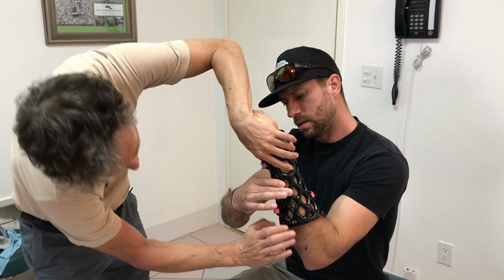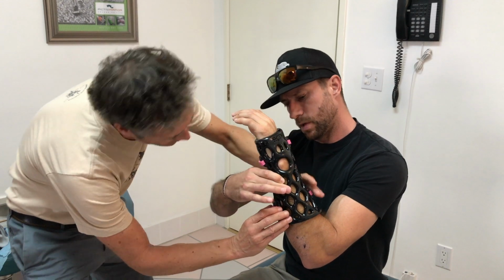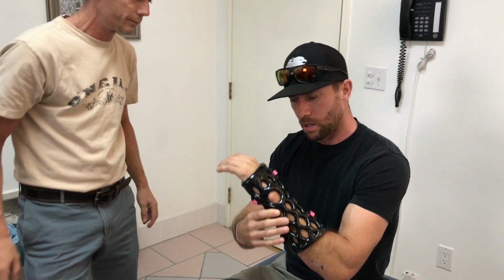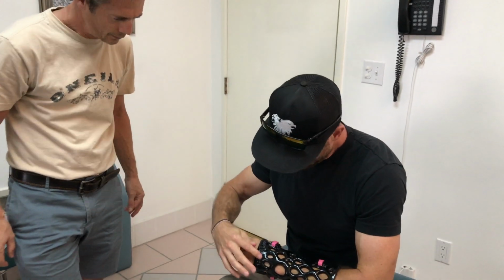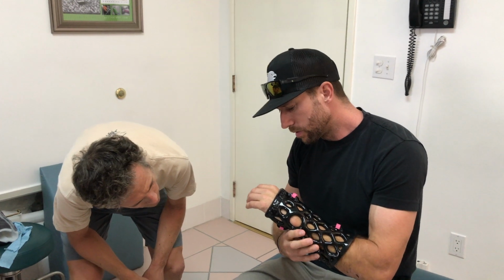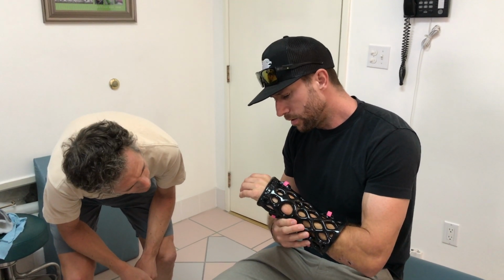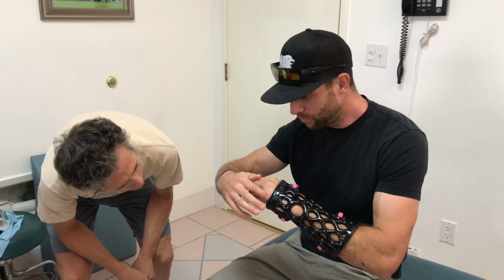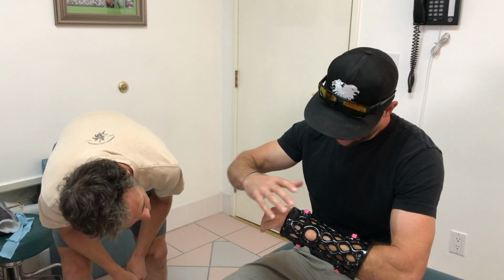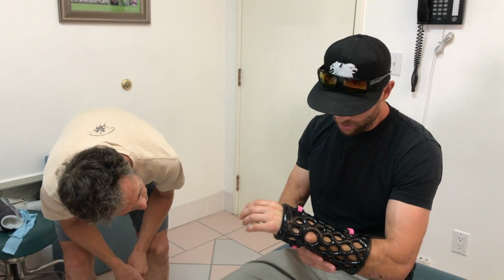So, what I do feel right off the bat is I think I'm going to probably need to take up a little bit of space here. So that's got some movement there. So I think we'll need to put some tape or something to pad that, just so it holds it a little more secure. But the thumb and this part, like this mold here, is spot on.